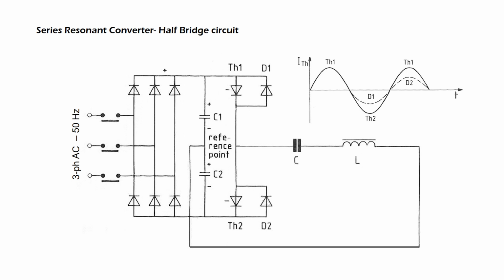The illustration in the top right-hand corner depicts the flow of current following the firing sequence of the thyristors and through the diodes following the zero crossing during the recovery period, before the other thyristor fires.